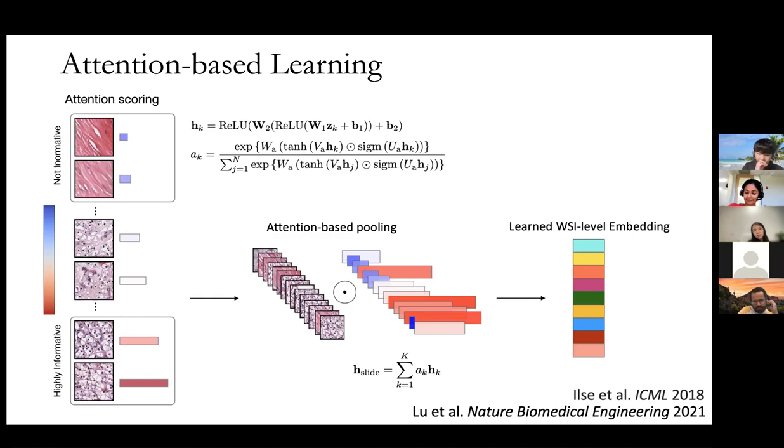I think the heat maps we show are pretty coarse, in the sense that it's just one score per patch. So it's not necessarily going to tell you, given that this patch had high attention, where the model is actually looking. In principle, you could still do that. You can use things like Grad-CAM or whatnot, and then pass the gradient from the attention scores all the way back through the ResNet pre-trained encoder to each pixel in the image.